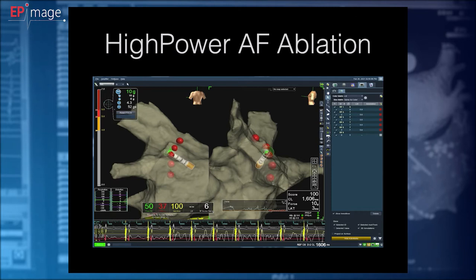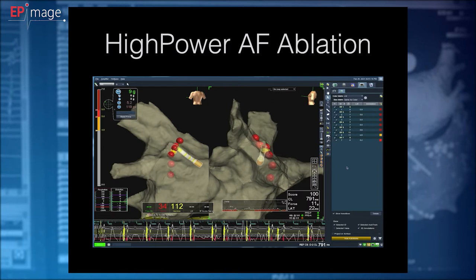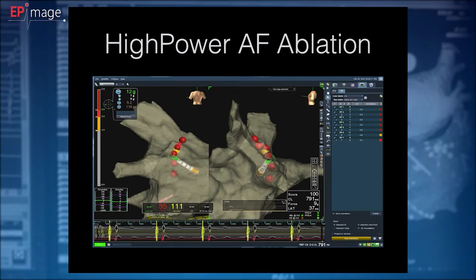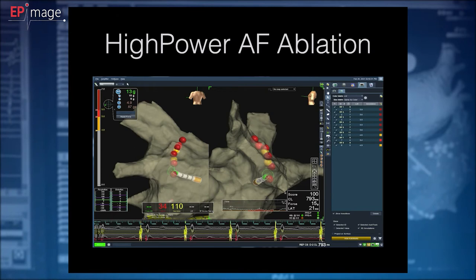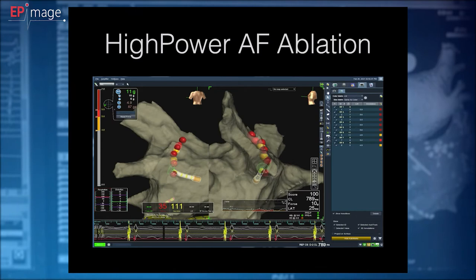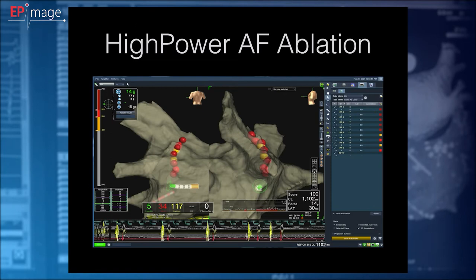When you think about cooling down of myocardial tissue after each radio frequency application, this myocardial tissue is being cooled down by blood flow. But behind the posterior wall of left atrium, we have some portion of fatty tissue, and behind that fatty tissue there is esophagus, and we are trying our best to avoid any injury, any overheating of esophageal region. That's why I'm jumping. I'm giving more time for fatty tissue, which cools down much slower than myocardial tissue, and with this method, I'm trying to minimize the esophageal injury.